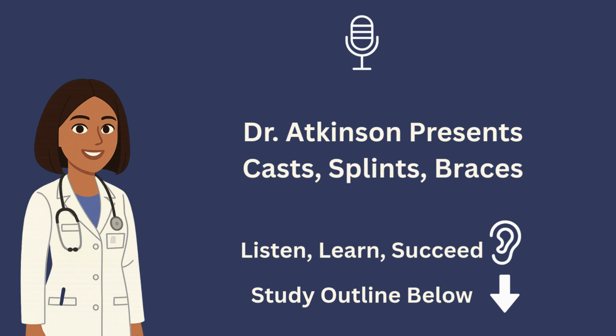After application, the nurse's top priority is neurovascular checks. Assess circulation, motion, and sensation every hour for the first 24 hours, then every 1 to 4 hours. The 5 Ps, pain, pallor, pulselessness, paresthesia, and paralysis, are red flags for complications. Pain is carefully evaluated. Normal pain should respond to elevation, ice, and medication. Unrelieved pain, especially burning pain or pain with passive movement, may signal compartment syndrome or pressure injury. Never ignore pain under a cast.